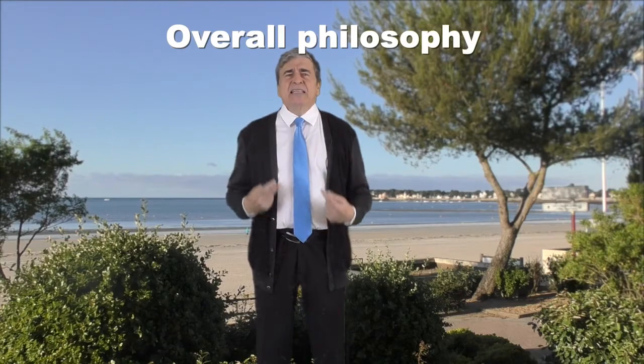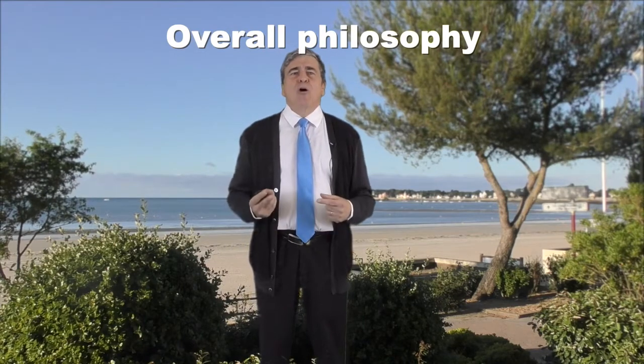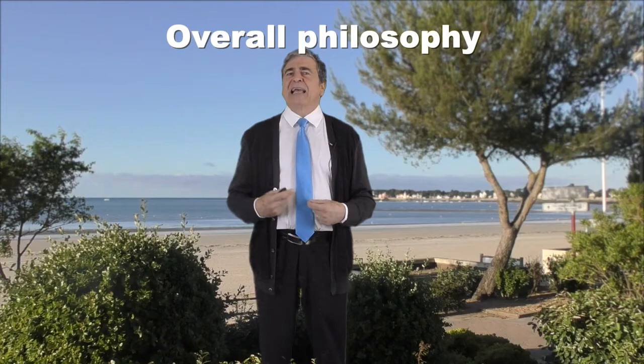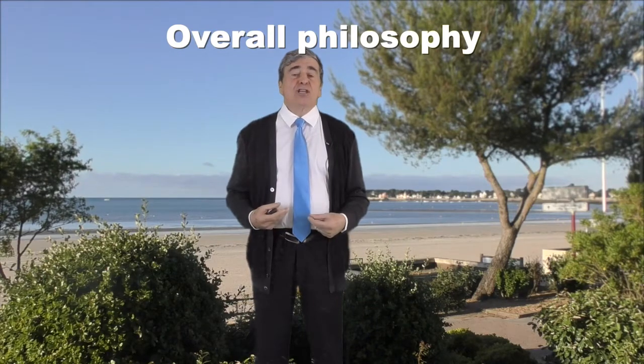Hello everyone. You now know that the best way to treat a patient with macular edema is to induce EGFR stimulation by removing the Müller cell hand feet during the ILM peeling. Here are some surgical tips to make your surgery easier and to avoid complications. This is my philosophy: to do perfectly what is necessary while avoiding everything that is not essential, which could complicate the gestures and increase surgical trauma.